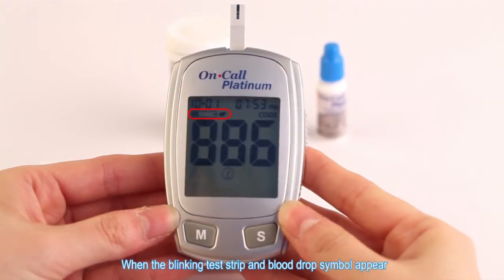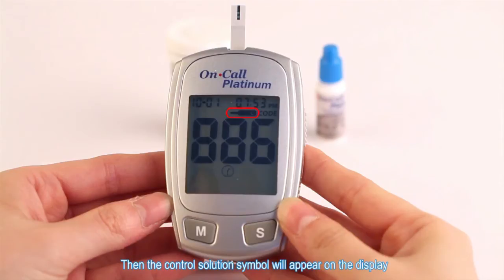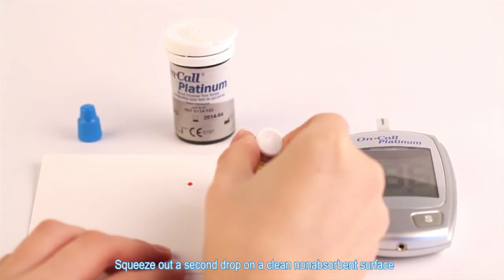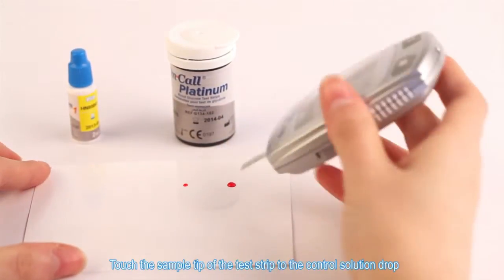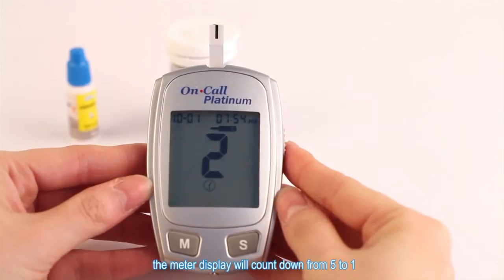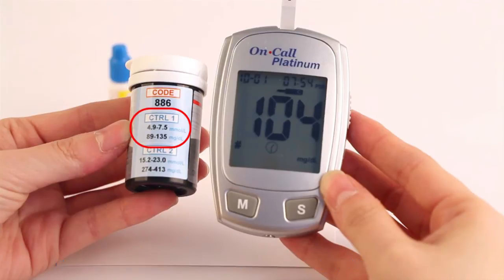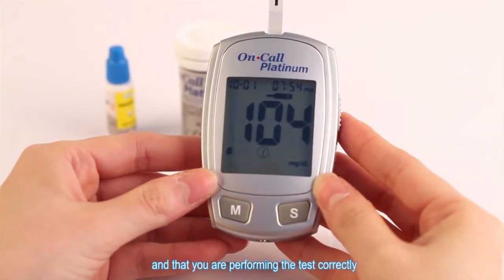When the blinking test strip and blood drop symbol appear, press the M button to mark the test as a control solution test. The control solution symbol will appear on the display. Shake the control solution bottle well, then squeeze and discard the first drop. Squeeze out a second drop on a clean non-absorbent surface. Touch the sample tip of the test strip to the control solution drop. Once a sufficient sample has been applied, the meter display will count down from five to one and then display the result. Compare the result to the control range printed on the test strip vial or foil pouch and make sure it falls within the range. This means the blood glucose monitoring system is working properly and that you are performing the test correctly.